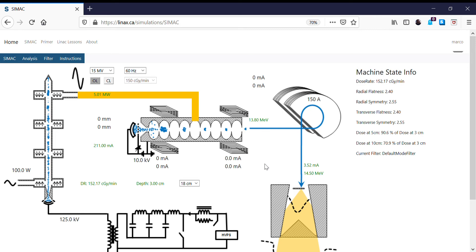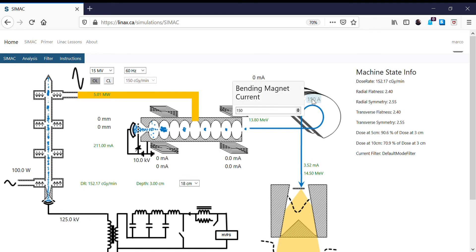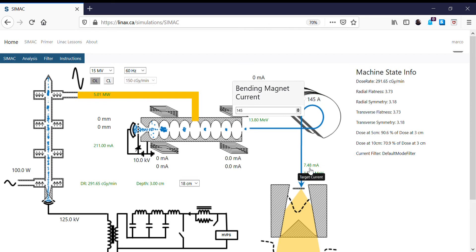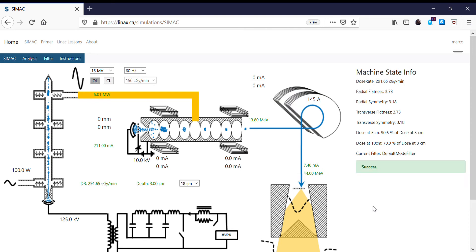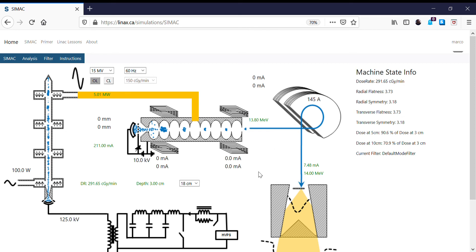So now the mean energy that the accelerator is producing is closer to what the bending magnet is allowing to go through. I'll continue to decrease this a little further. So now I'm going to go to 145 amps. So now I have a 7.48 milliamp beam. We have a 14 MeV beam on the target, which is again very close to our 13.8.